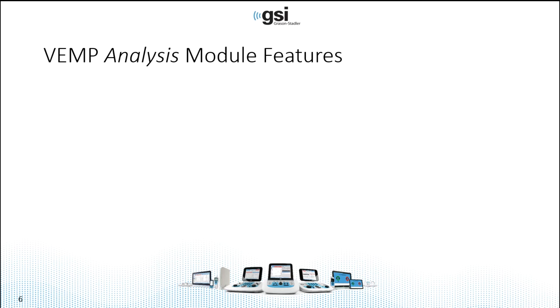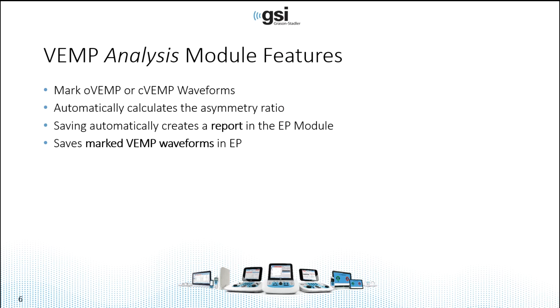The VEMP analysis module features the ability to mark the OVEMP and C VEMP waveforms. It will automatically calculate the asymmetry ratio for you, and when you save the record, it will automatically create a report in the EP module. The VEMP analysis module is outside the EP collection module. Once you've marked and saved the waveforms, they will be stored in the EP module for future reference.